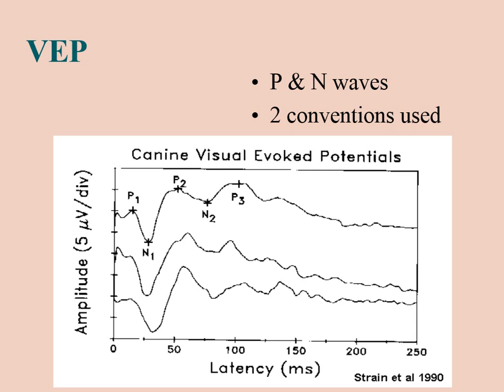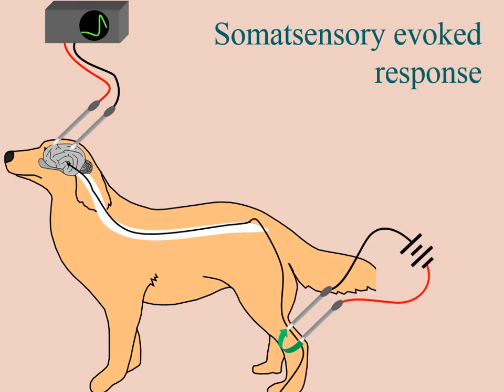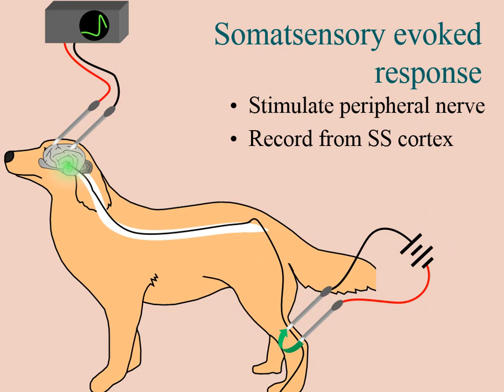The latency has the same problem. If you've got a slowed conduction and the P45 wave or whatever it is way out here, do you call that the P100 wave because now it's at 100 milliseconds? So it gets to be kind of a nomenclature conundrum with these evoked potentials. And often the waves aren't nearly as distinct as with the brainstem. We can also do somatosensory evoked responses where we can stimulate the peripheral nerve, send an impulse all the way up to the spinal cord to the brain and record from the somatosensory cortex.